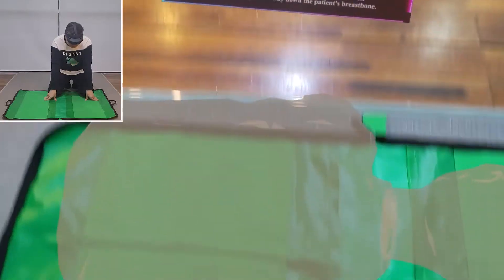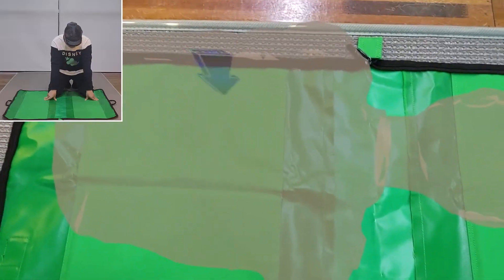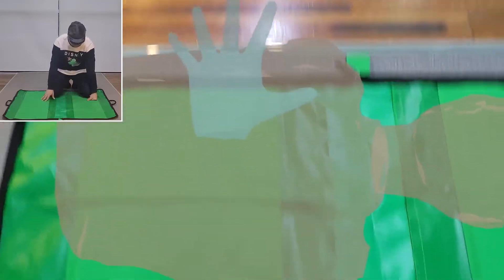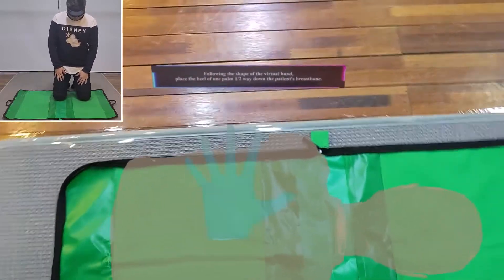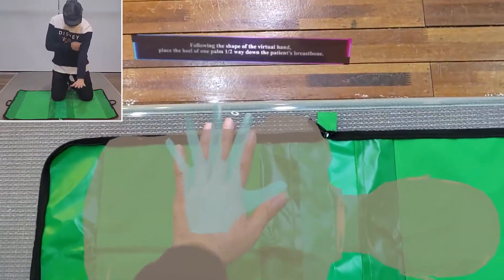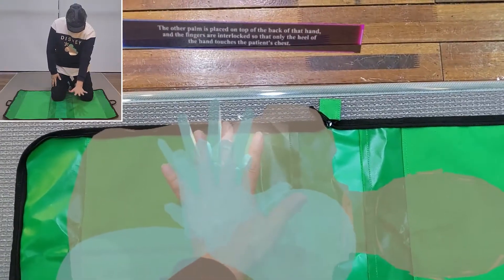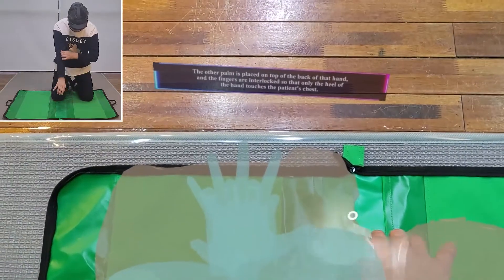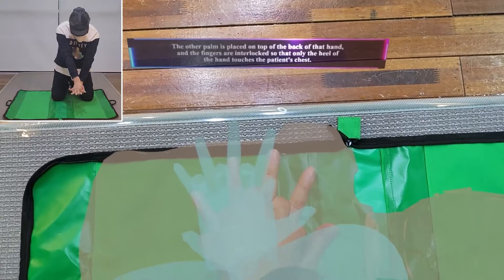Take turns doing CPR before the defibrillator arrives. First, identify the point one-half way down the patient's breastbone. Following the shape of the virtual hand, place the heel of one palm one-half way down the patient's breastbone. Place the other palm on top, fingers interlocked, so that only the heel of the hand touches the patient's chest.